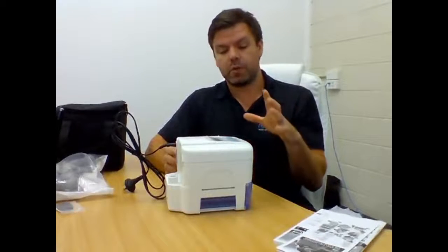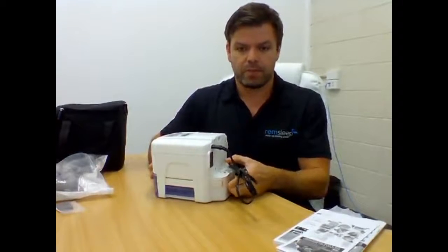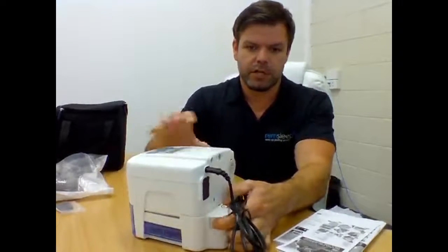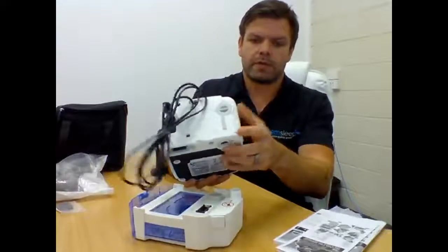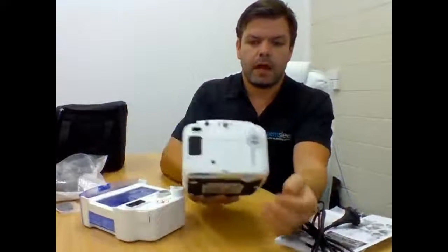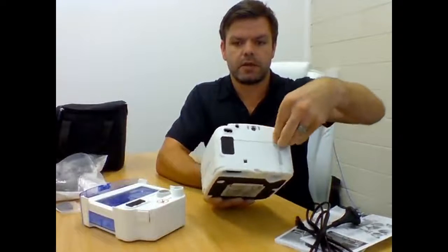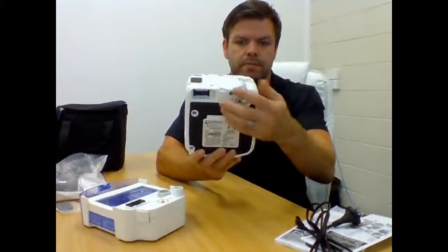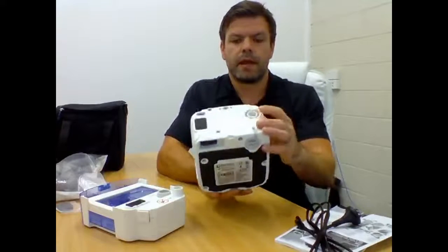If you want to use the machine without the humidifier, it's very simple to do. To detach the humidification chamber at the bottom there's a little button on the back here, and if we press that in, it sort of pops up the machine, and we can just take it off. Now all we have to do is pull out, I'll just get this cord off because that's a bit frustrating for me, this little plug stopper here from the back. We just take that out like so, and we place it in the bottom. There's a hole in the bottom there, so we place that in the bottom, like so.